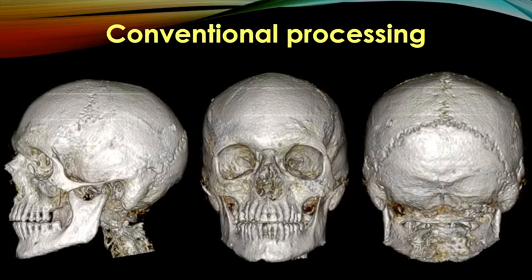You could even do 3D reformats, which look pretty nice. So most people would not believe that this came from an MRI. They would think it had to be a CT, but no. The only problem is that the assumptions we make in conventional image processing don't always hold for patients with pathology or younger patients. In particular, these patients may have thinner and less ossified bone, less well-developed soft tissues, and variable secretions in the sinuses and the mastoids.